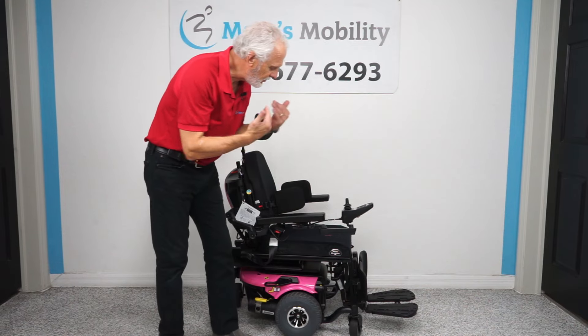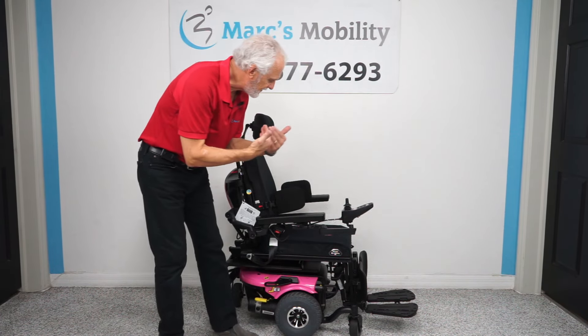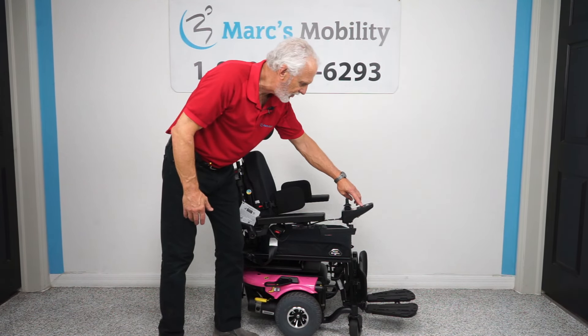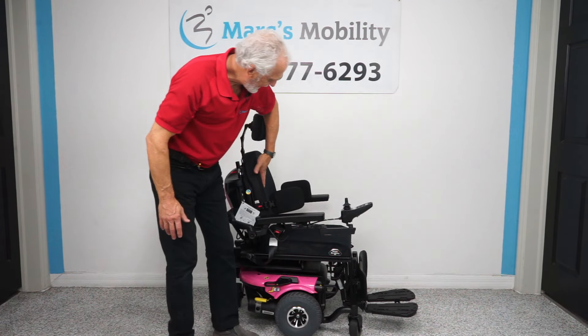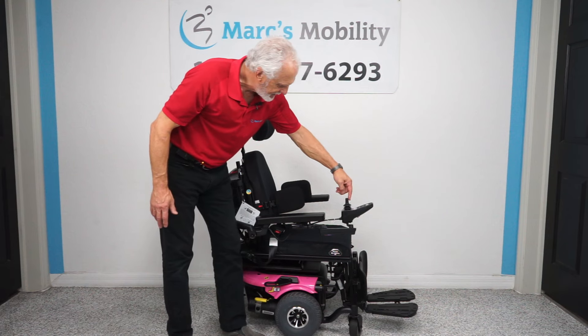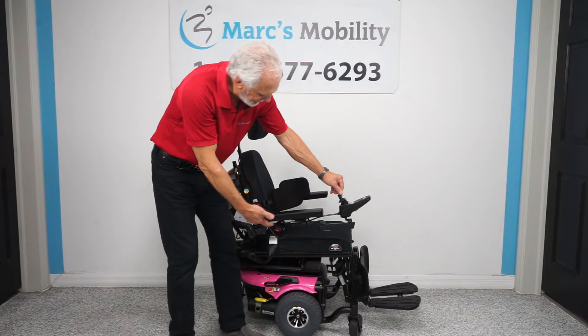The first thing we'll do is look at the tilt and the legs. If you want to make the seat tilt back, you go to the joystick. There are two blue buttons with arrows on it. Push any one until you see a picture of your chair on the screen. When the bottom and the back are black on your screen, then you can go to the joystick, push it back, and you see how it's starting to tilt.